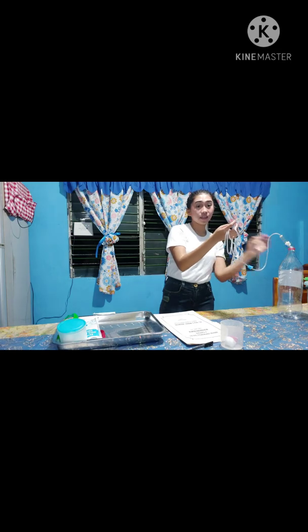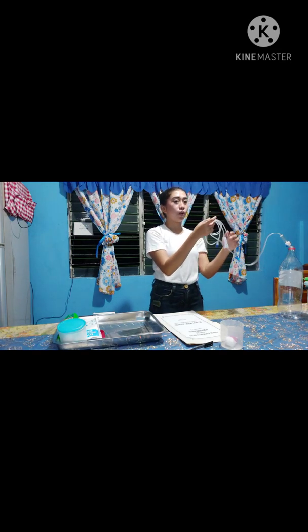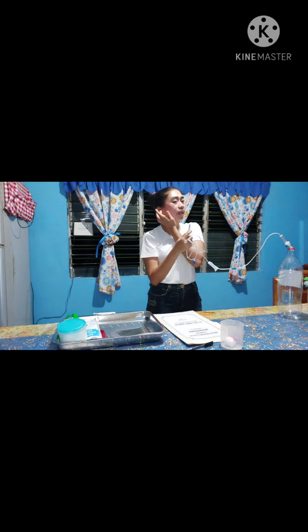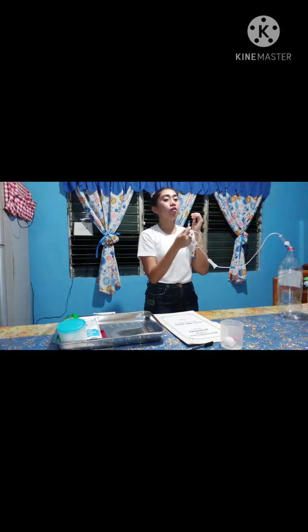And then the next step is to open the end port. So this is the end port. And then whenever there's no air in the tubing, the next step is to close the end port and then bring the equipment together with the prepared IV solution to the patient's bedside table. It is for us to save time and energy. And that would be all.